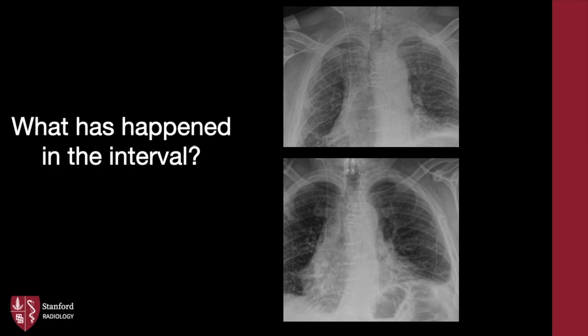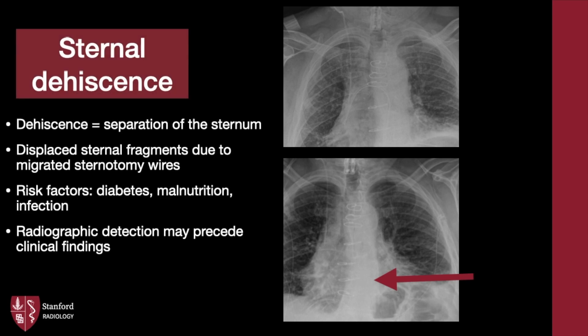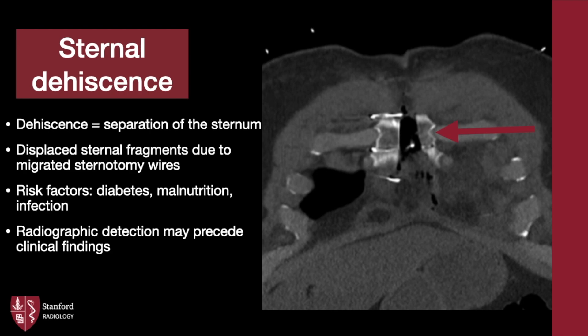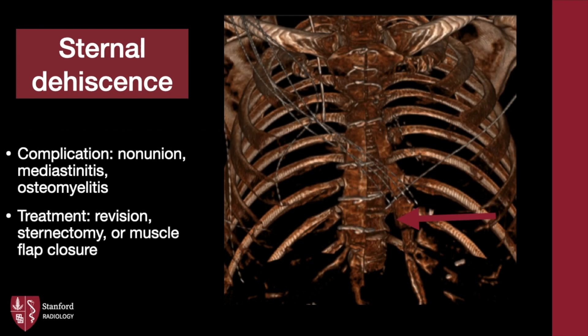In our next case, what has happened in the interval? On our first radiograph, the sternal wires are nicely aligned and intact. A second one shows malalignment of the lower sternal wires. This is sternal dehiscence, defined as separation of the sternum. It is commonly seen in the early postoperative period with risk factors being diabetes, malnutrition, and infection. Migrated sternal wires may lead to displaced, rotated, or disrupted sternal fragments. Radiographic detection may precede clinical findings, which is why identification is very important. The big concern is for associated infection in the mediastinum. Treatment requires revision, sternectomy, or muscle flap closure.